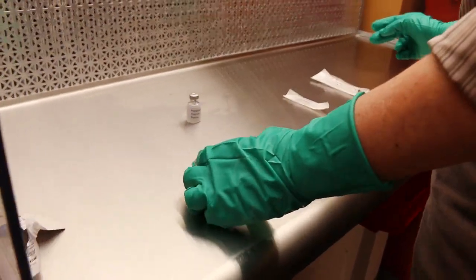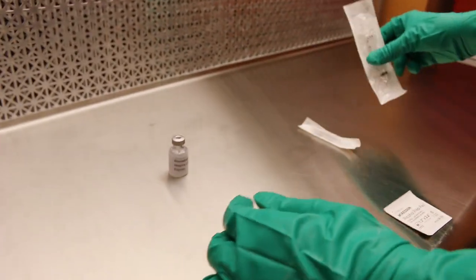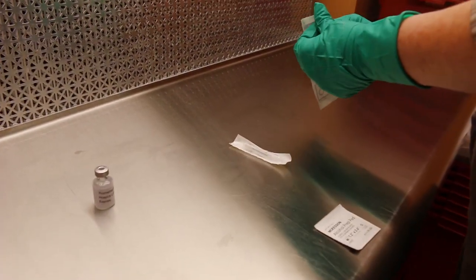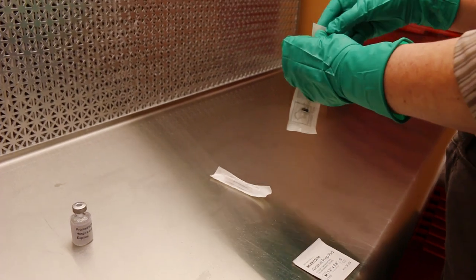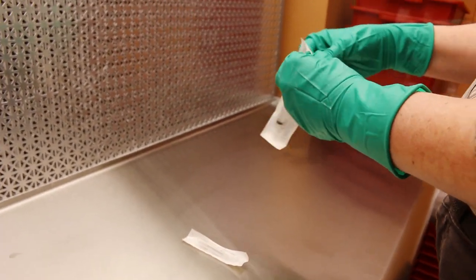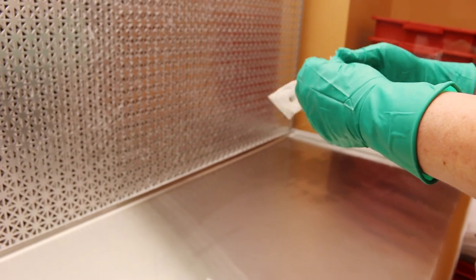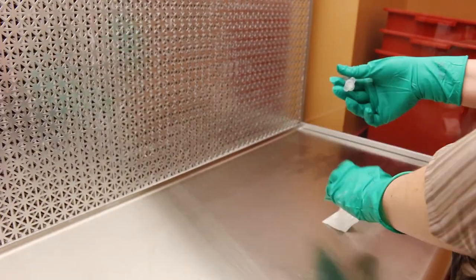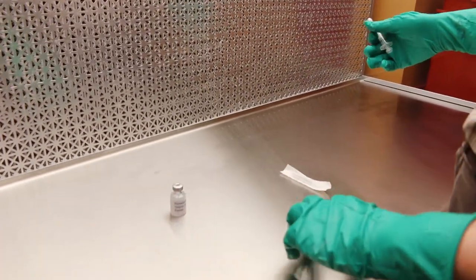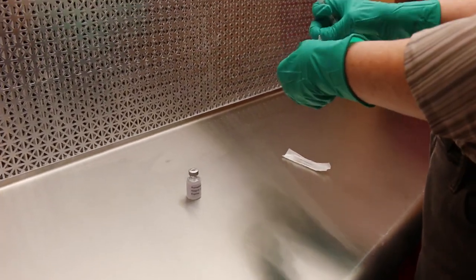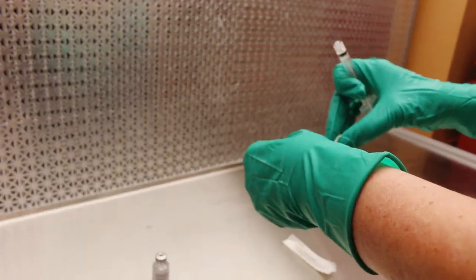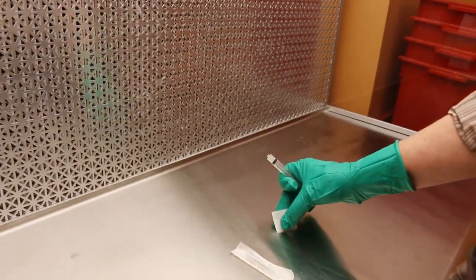Step eleven, bring the syringe into the direct compounding area, and remove the outer wrapping without touching or shadowing the syringe tip. Dispose of the syringe wrapper in the discard pile. Step twelve, open a sterile alcohol swab and place it on the work surface of the hood, and discard the wrapper in the discard pile.